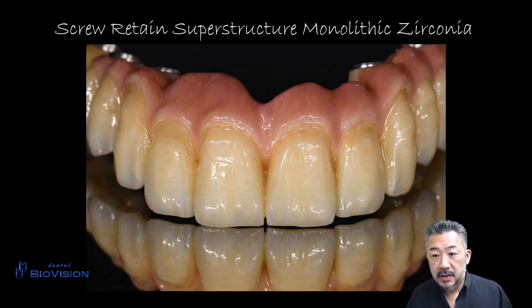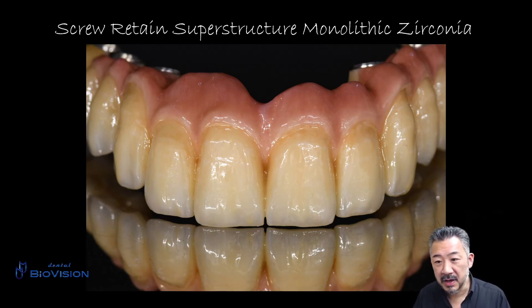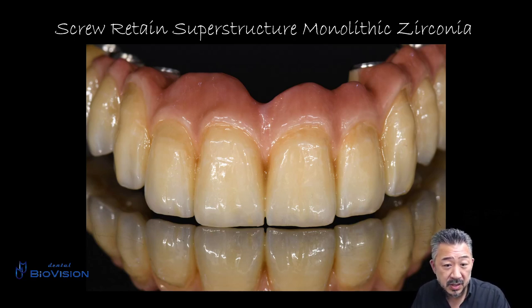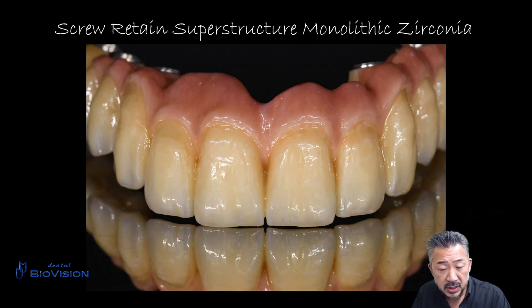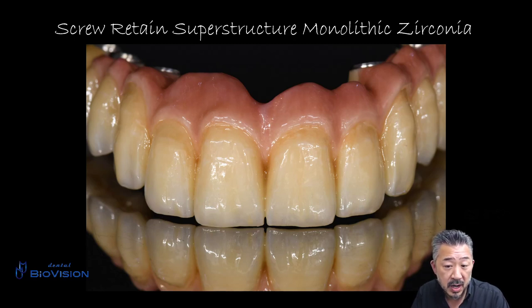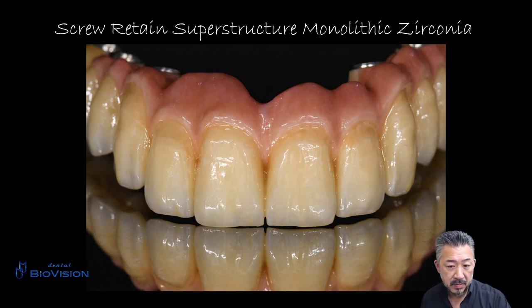Hi guys, this time it's a video spoken in English. I'll explain the process of taking data for upper full-arch implant using an intraoral scanner and completing the screw-retained superstructure with monolithic zirconia. The intraoral scanner used is 3Shape Trios, the design software is 3Shape Dental System, and the zirconia is a single color high-translucency 30mm disc that is not multi-layered.